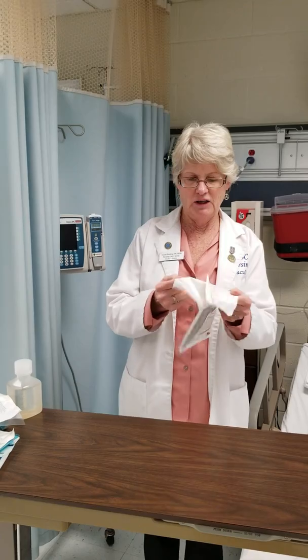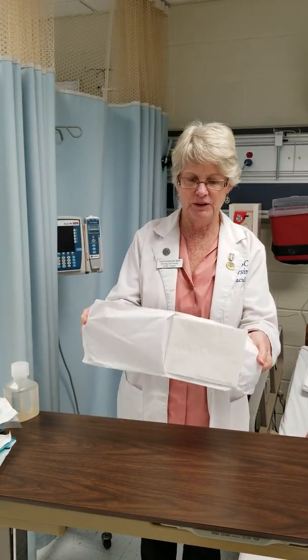Today I'm going to demonstrate setting up a sterile field. I'll start with my sterile drape and I will peel it apart at the edges to open my package. I will stay away from my field as I open my package. Open it and then drop it directly on the table and dispose of my packaging.